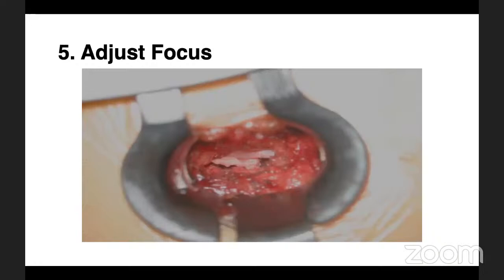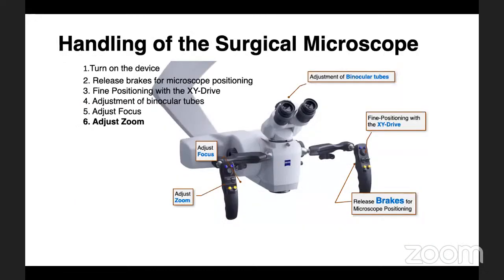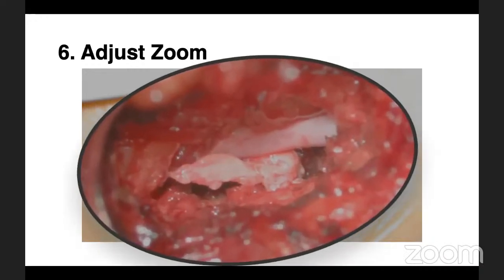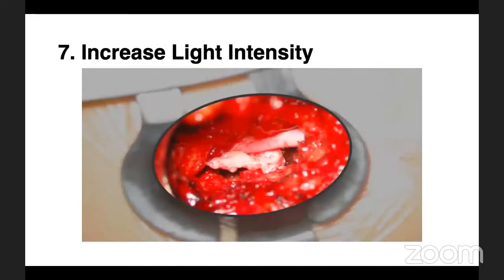You have to adjust the focus properly so that the image is clear and sharp. You have to zoom in according to the requirement of the procedure, and increase the light intensity till you're comfortable.